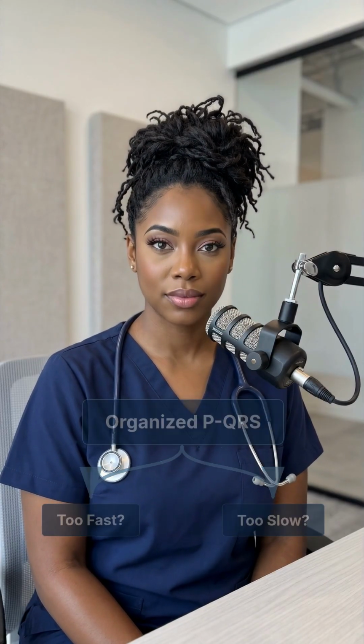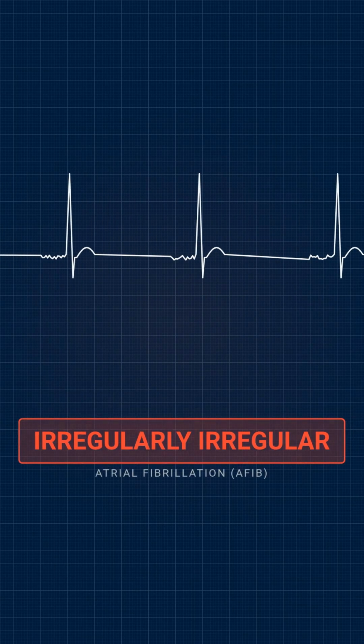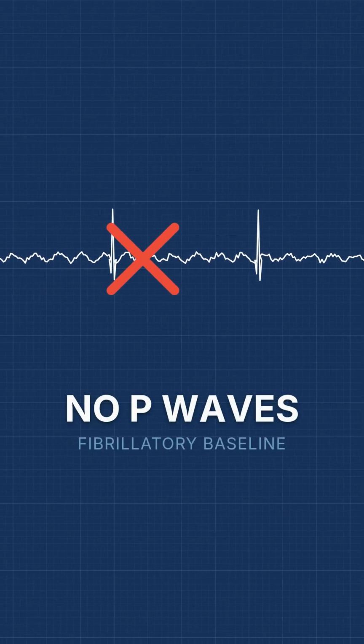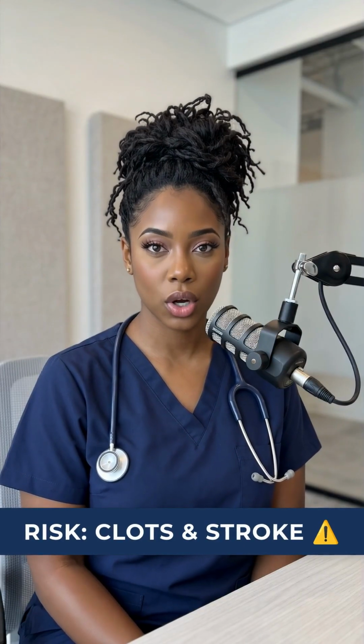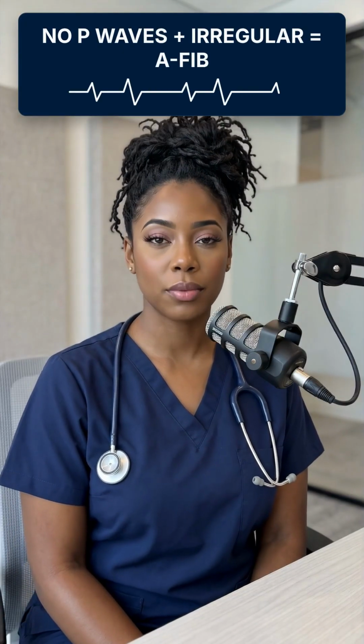fast or too slow? Now let's talk about one of the most tested rhythms in cardiology, atrial fibrillation. Atrial fibrillation is irregularly irregular. There are no clear P waves, and the rhythm is chaotic. So if you look at the strip and it looks messy, unpredictable, with no P waves, think AFib. This matters because AFib increases the risk of clots and stroke. We need to catch it early. So remember, no P waves plus irregular rhythm equals atrial fibrillation.